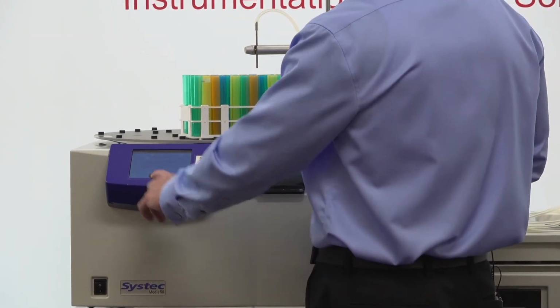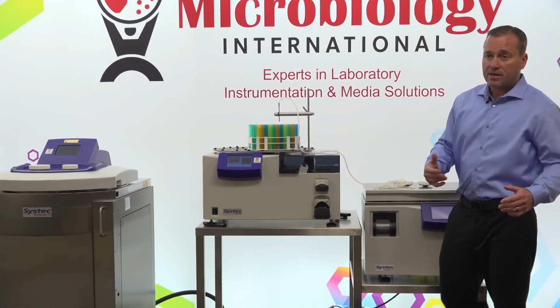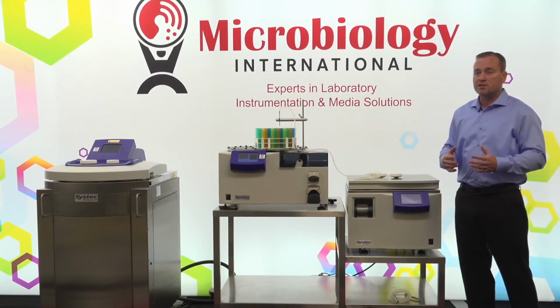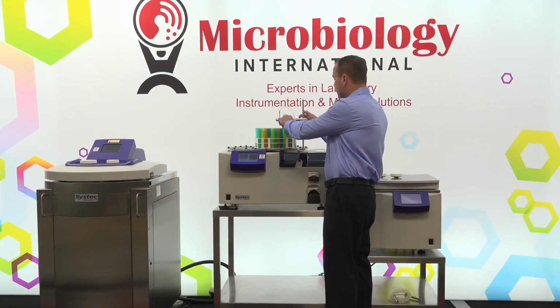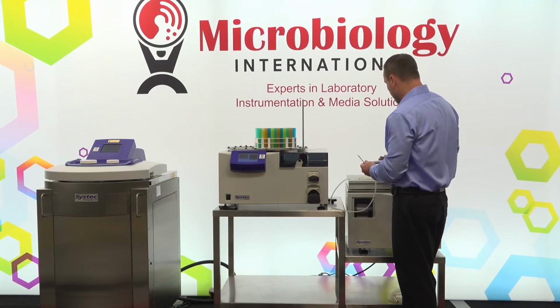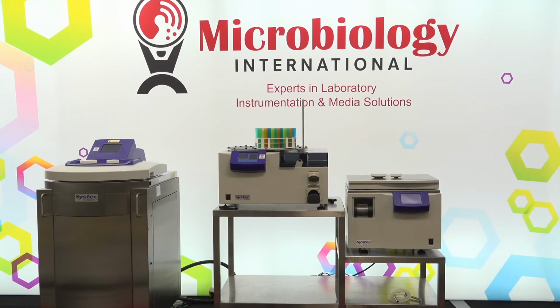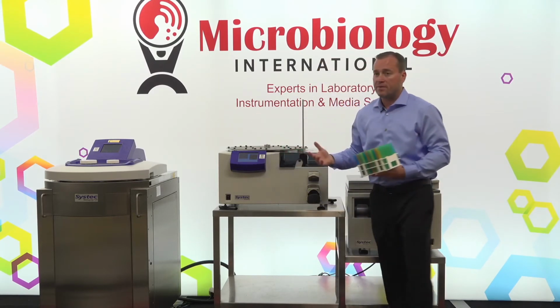So just go ahead and stop that and go back. And now I'm going to change this back into the plate pouring device. So just to give you an idea of how easy it is to transfer them from one type to another. The other thing that we have mentioned while we were talking is also 60 millimeter and also 35 millimeter plates. In order to do that application, we would need to change the revolver and also the carousel. So those are the only items that we would need to change in order to make this do another type of plates.